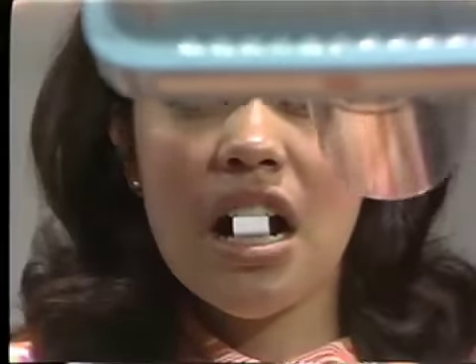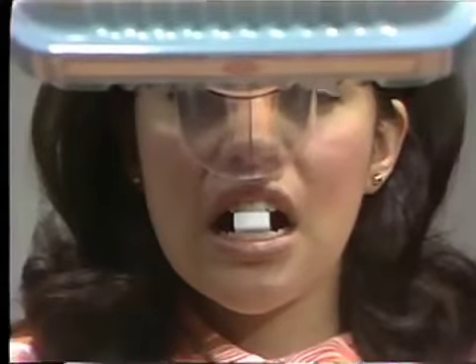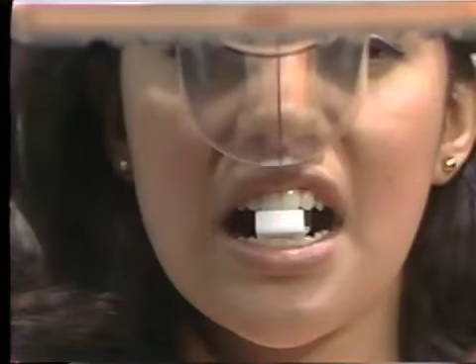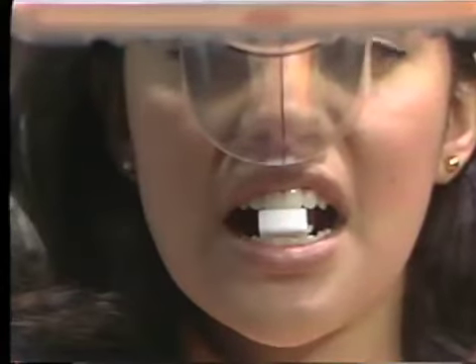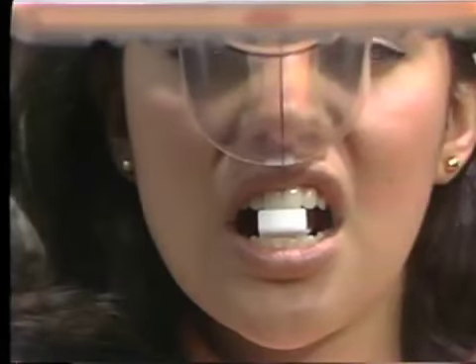So we bring the X-ray machine into position so its lower edge of the cone is slightly above her teeth. And we have chosen the horizontal direction so that the black line on the underside of the cone is pointing right down between her teeth. This is the same direction we must sight in order to see between these teeth.